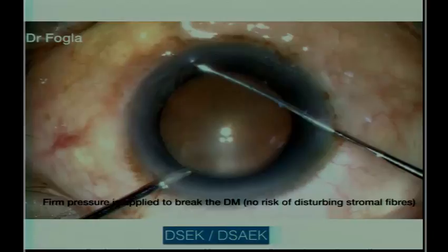And I think in DMEK, it's important that your inner surface should be relatively smooth. If you do have irregularities, it can affect the attachment of the Descemet's, especially when the air bubble is becoming smaller, and you can have this peripheral edge that kind of detaches. What size should it be? That's again controversial. Some people make it a little smaller. Some people want to make it a little larger.